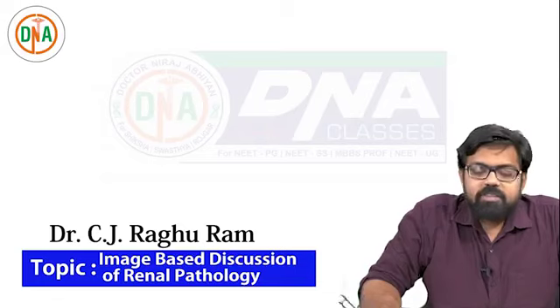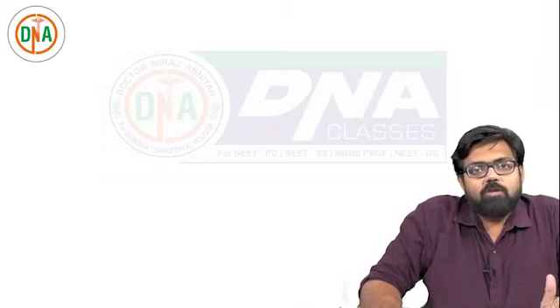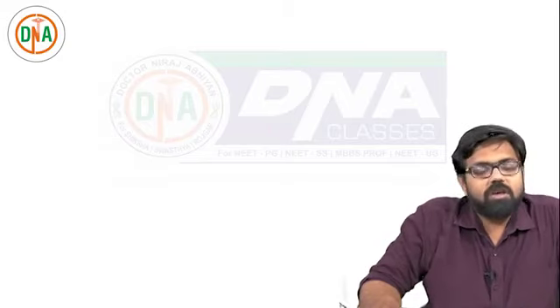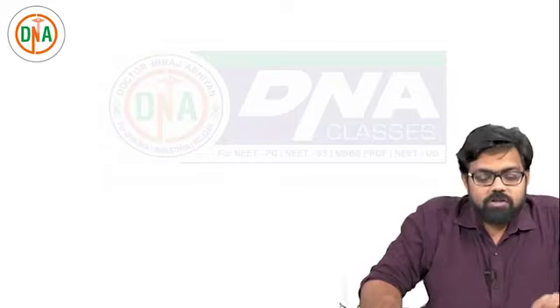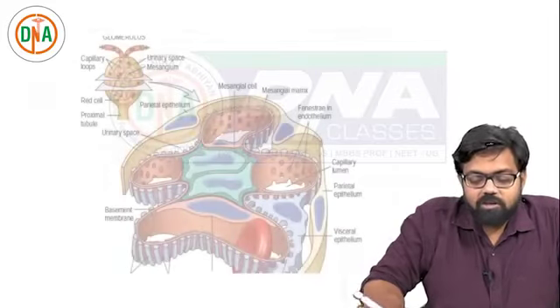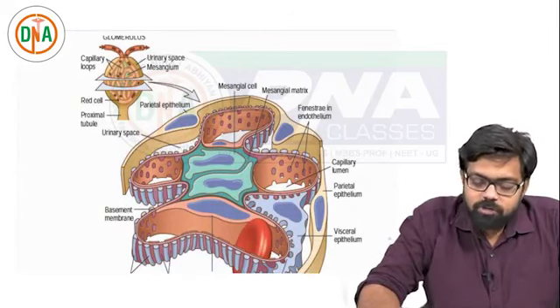Okay, so what we have discussed much earlier is about the complete renal pathology. We discussed the normal histology, the different microscopies, the kind of deposits, glomerulonephritis, everything. So this is completely an image-oriented session of the renal pathology. So let's rush through the images over here. Most of the images are from your textbook Robbins only.